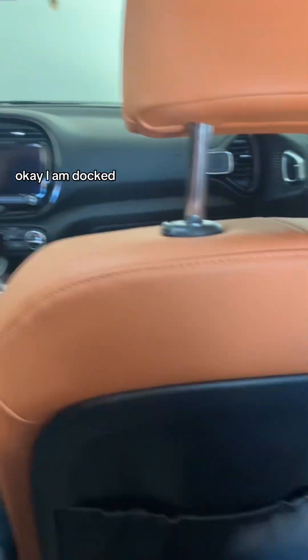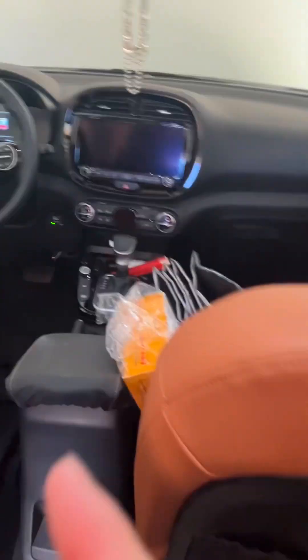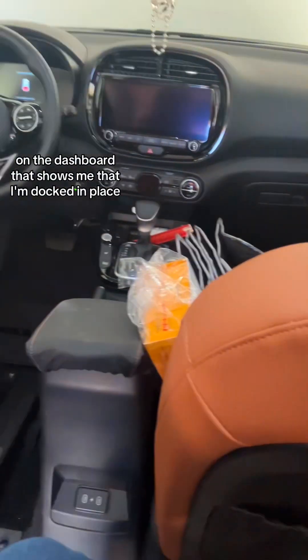I am docked — there's a green light showing there on the dashboard, confirming that I'm docked in place.